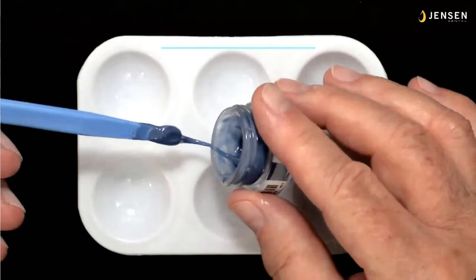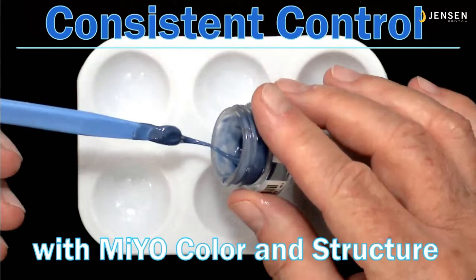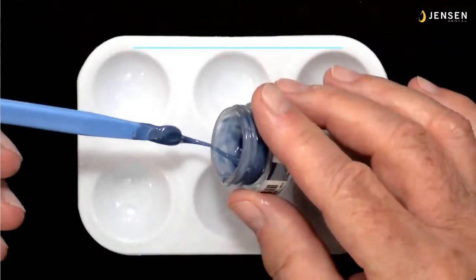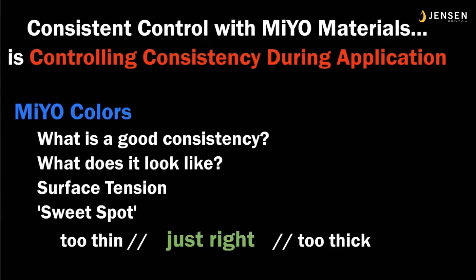What we have here in our title slide is pulling some cobalt out of a jar, and you see how it's stringing off the spatula, but it's sagging out the lip of the jar. This is what we're looking for as our baseline of viscosity for the colors. We want it to come out like a honey, but we want it to sag. So controlling consistency during the application is our consistent control.